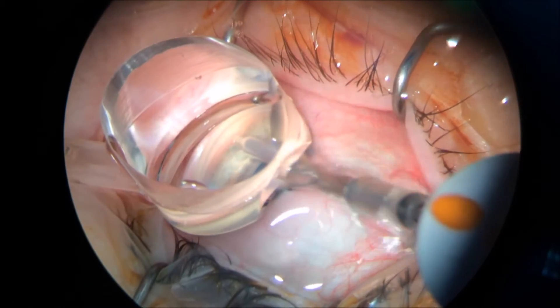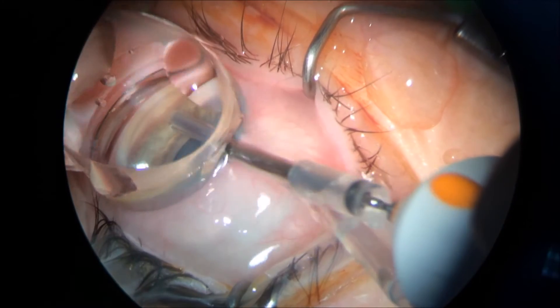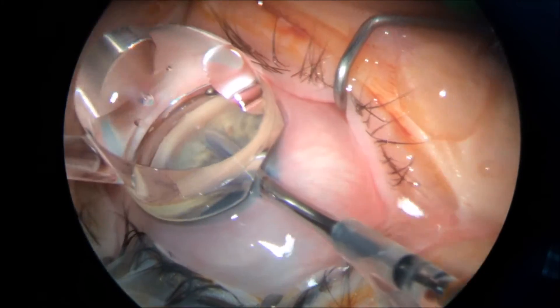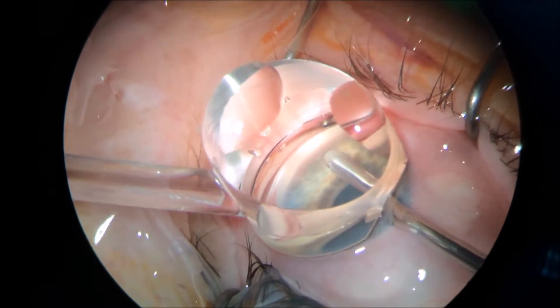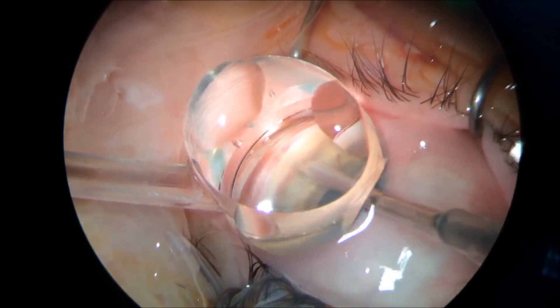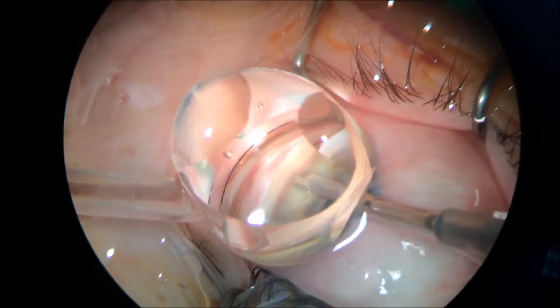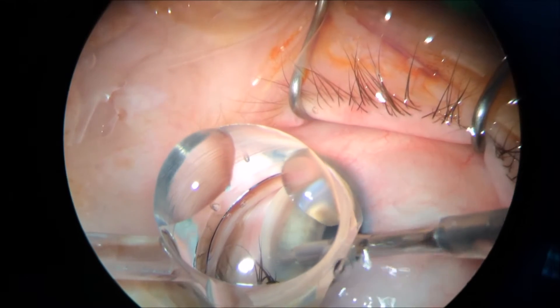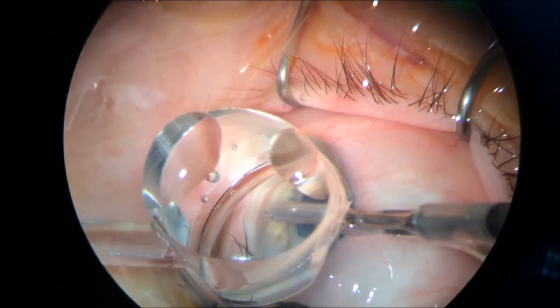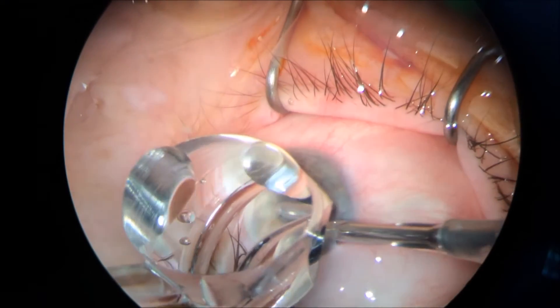What this procedure is doing is removing very thin slices of trabecular meshwork, vacuuming the trabecular meshwork, and aspirating all that pigment. Notice the small dust that was coming out and quickly removed to the vitreocutter's port.